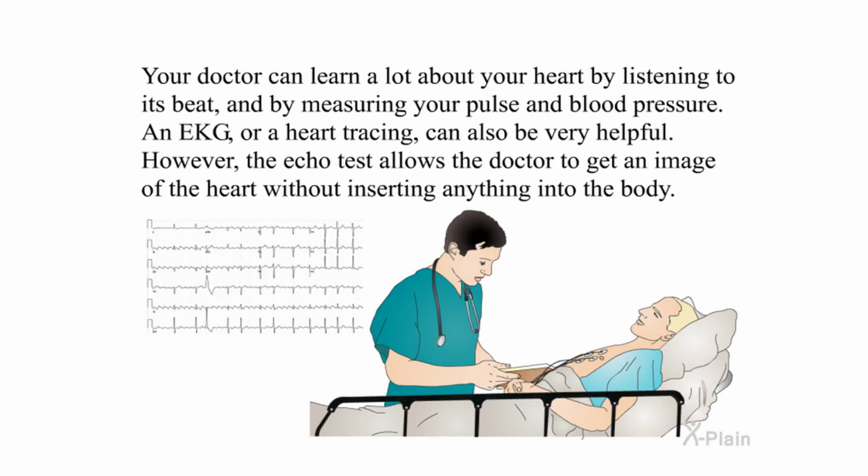Your doctor can learn a lot about your heart by listening to its beat and by measuring your pulse and blood pressure. An EKG, or a heart tracing, can also be very helpful. However, the echo test allows the doctor to get an image of the heart without inserting anything into the body.